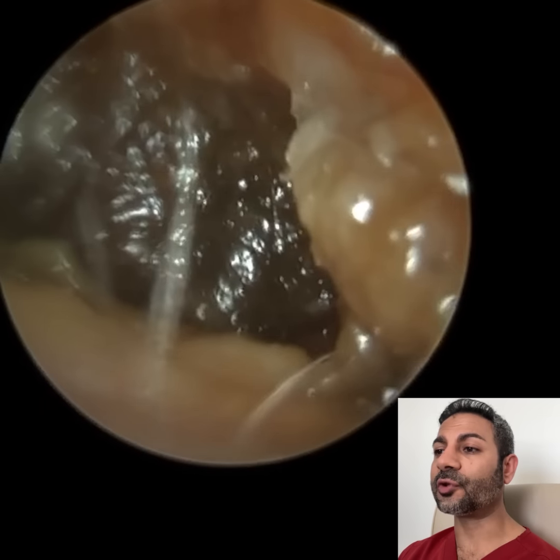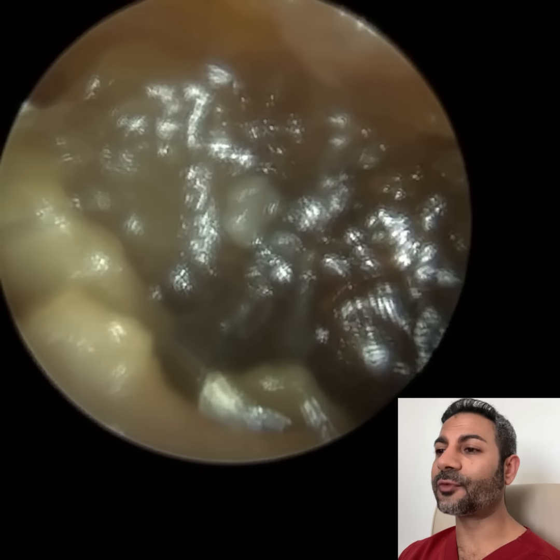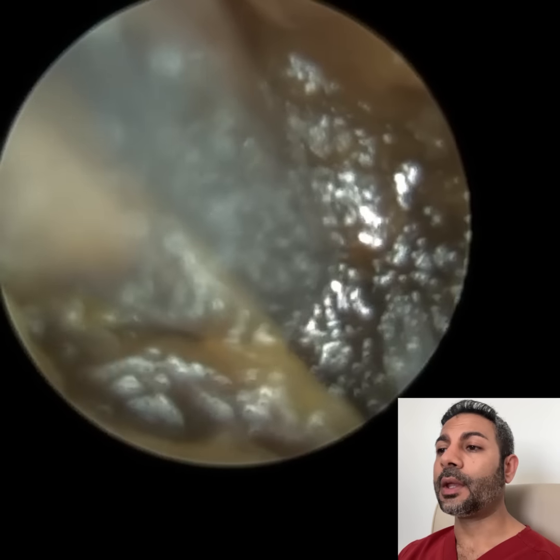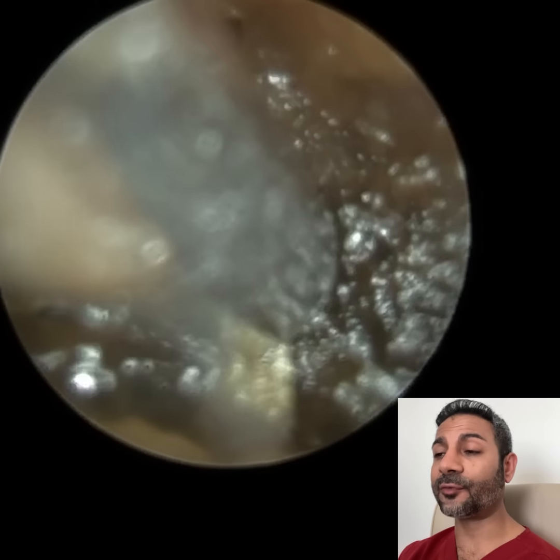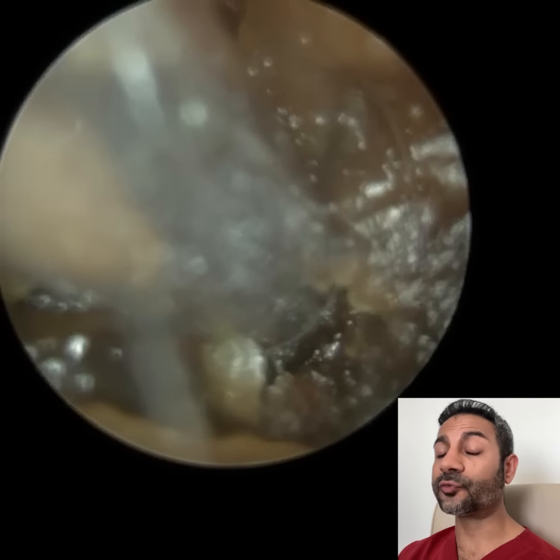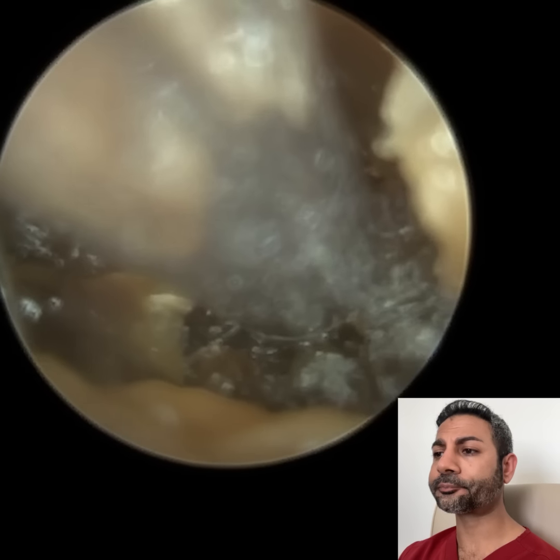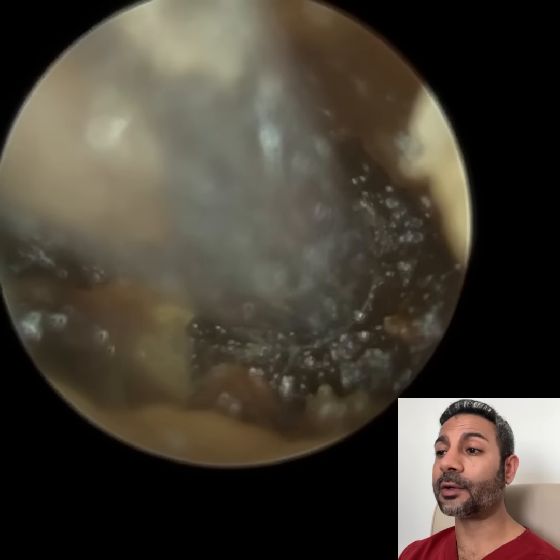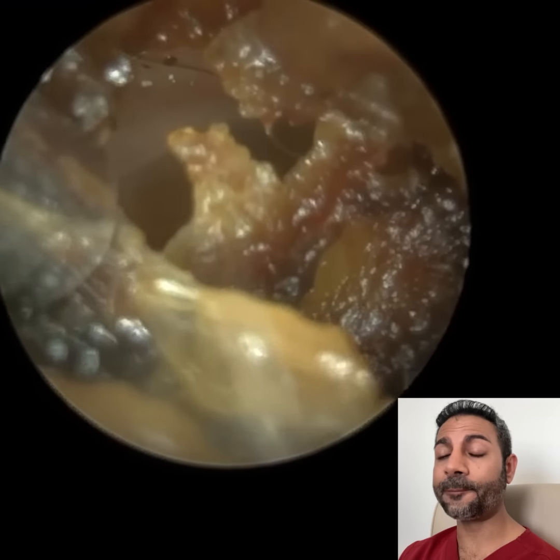This is a patient who attends biannually. A few years ago, when they first attended, upon removing the wax and dead skin, particularly at the base of the ear canal, a bit deeper on the osseous portion, there was an ulceration with some exposed bone. There was some otorrhea in that region. For that reason, we referred this patient to ENT to rule out a possible rare external auditory canal cholesteatoma.